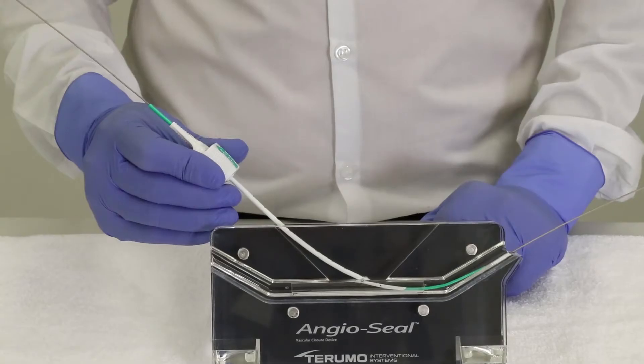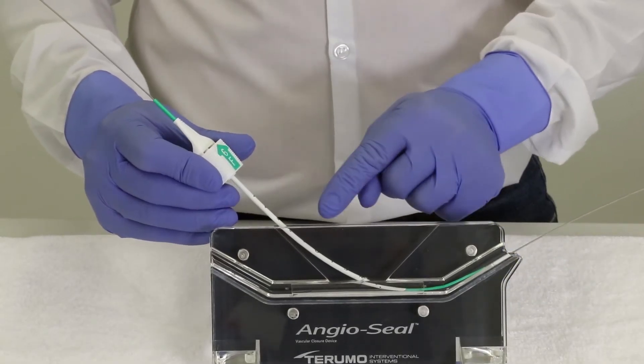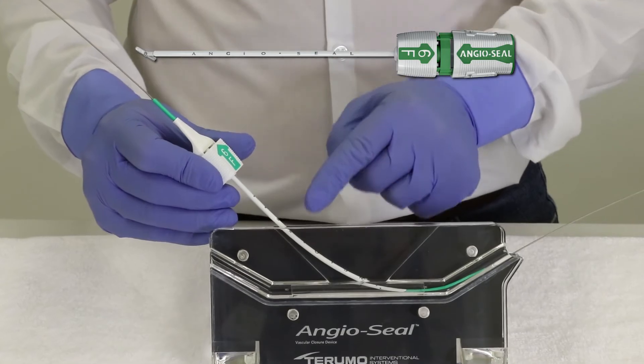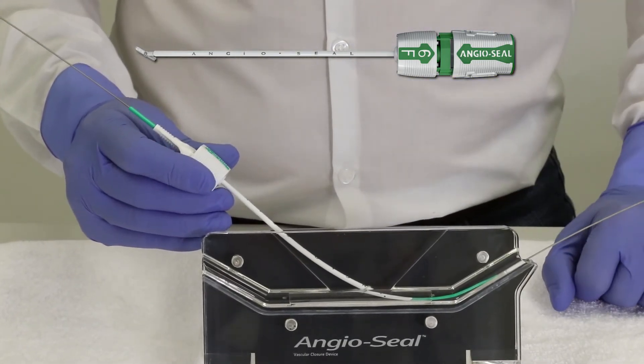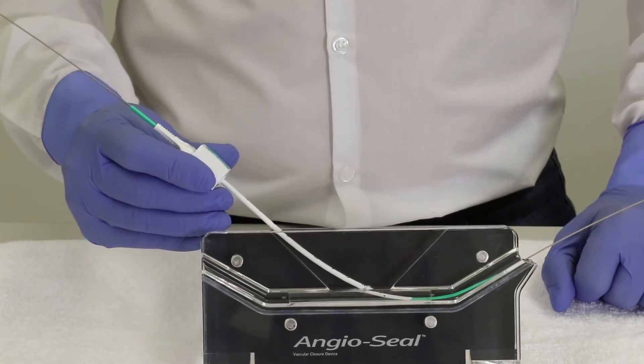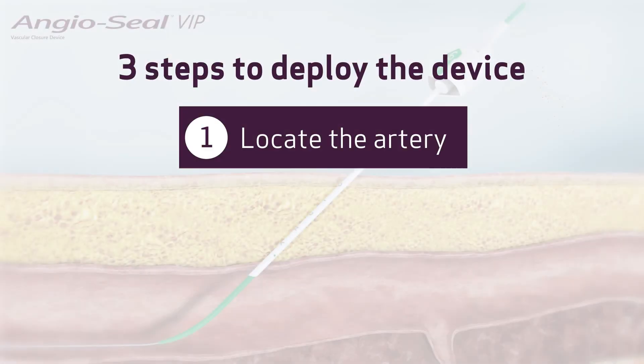Look at the letter on the sheath which indicates your depth. There's one centimeter between each letter. It's a kind of marker to help you assess how deep you are in case it were to come out or move. This step is called locate the artery.